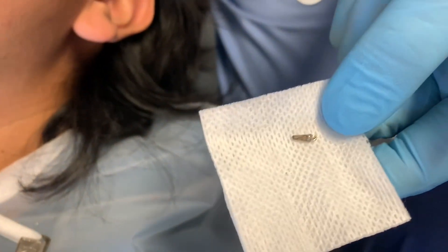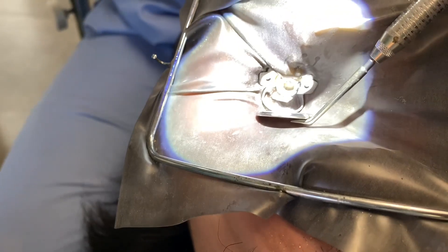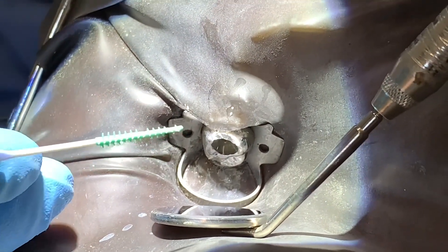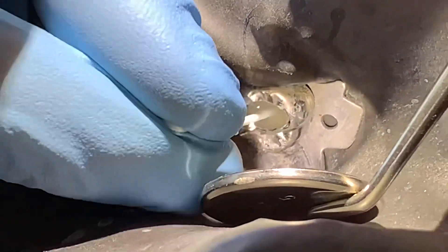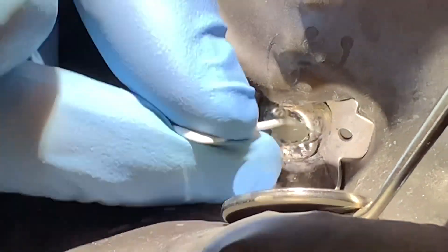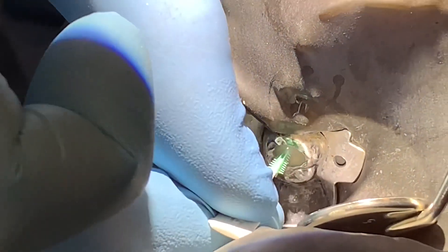Look at the size of the post and how large the post is. The palatal root is pretty wide. So what I'm going to do is use one of these interproximal brushes and just scrape the inside of the canals with it. They're pretty enlarged already — it's like one of those baby bottle cleaners. You can see all kinds of stuff coming out now.